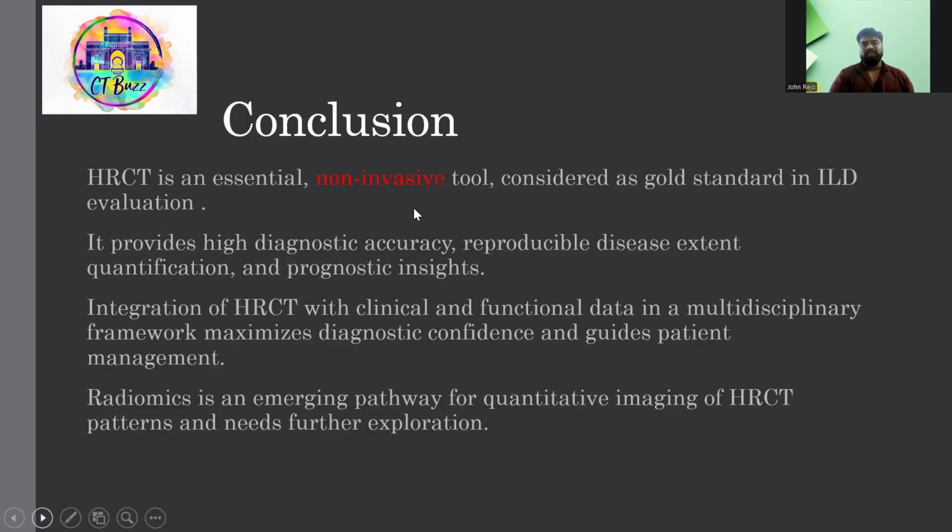Conclusion: HRCT is an essential non-invasive tool, now considered the gold standard in ILD evaluation. It has high diagnostic accuracy. It is reproducible and quantifiable, and prognostic insights are there. Radiomics is an emerging pathway, as we see. It gives a quantitative assessment of the different qualitative aspects of the HRCT and reduces inter-observer variability.